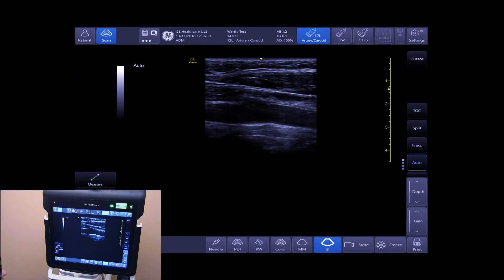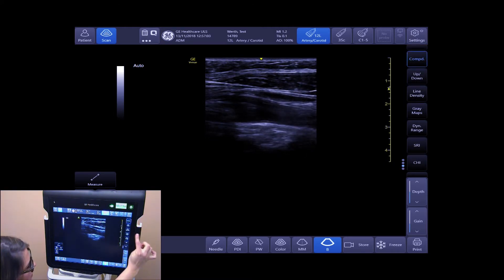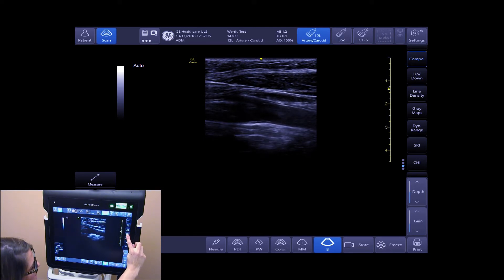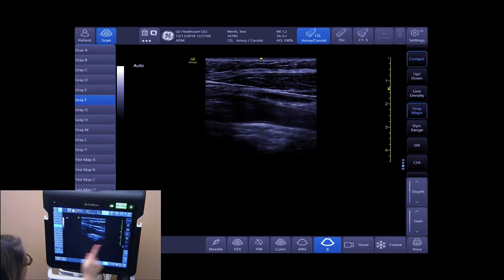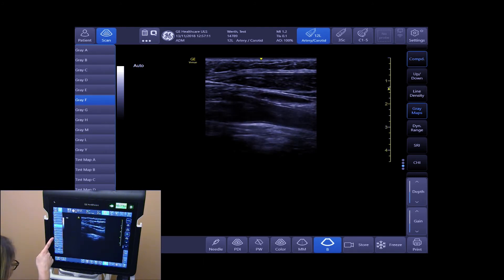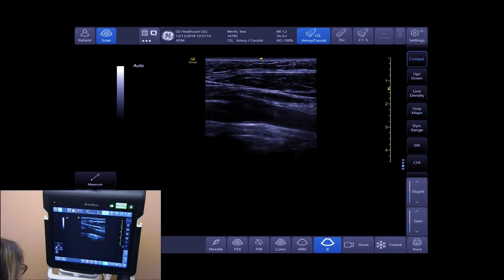To adjust your gray maps, slide on the sidebar menu, select gray maps, and adjust your gray maps as needed. Your gray maps will display your B-Mode image in different shades of gray.